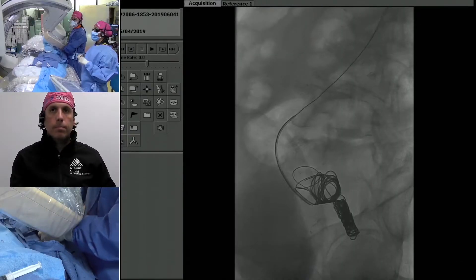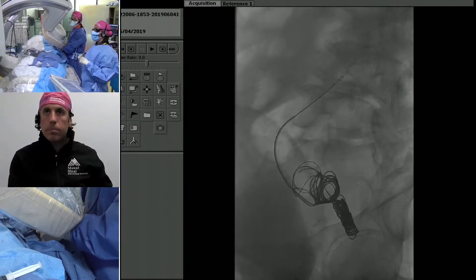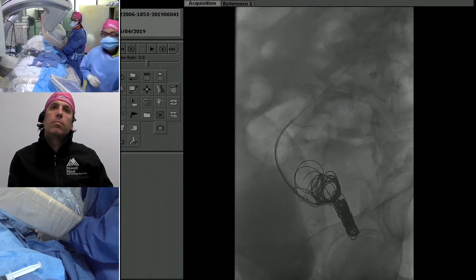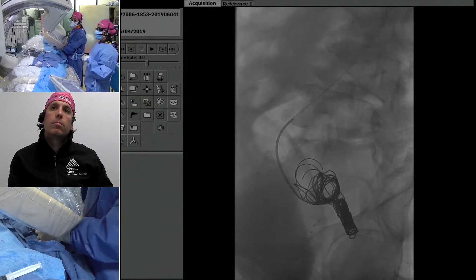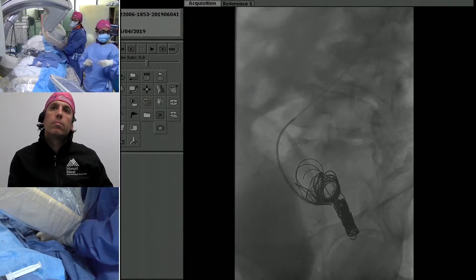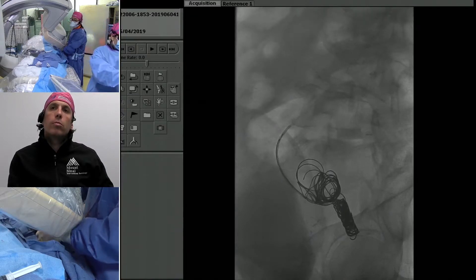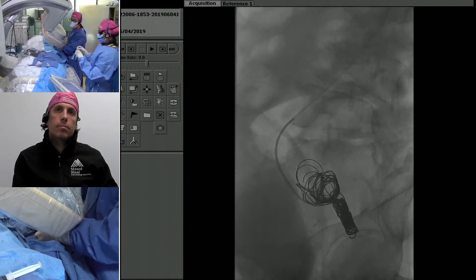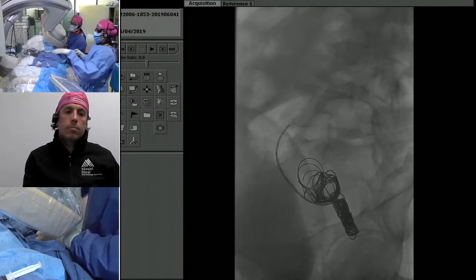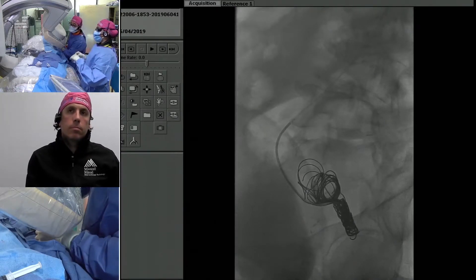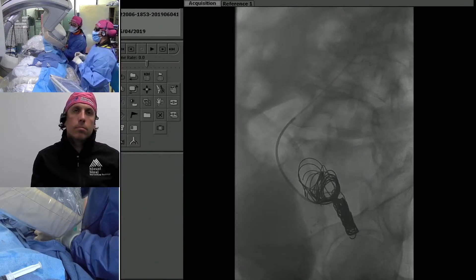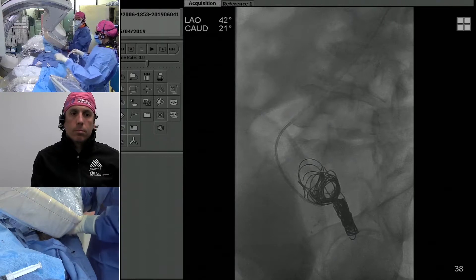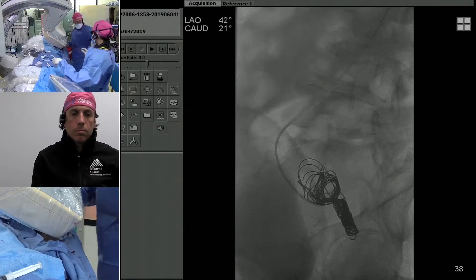So now this is the O35 20-by-40 interlock going in, and it's actually tracking very nicely all the way through. We've changed our angle a bit to confirm, especially with this much tortuosity, that we're not anywhere near the external iliac — which we're not. That delivered very nicely. We'll pack a couple more of these.